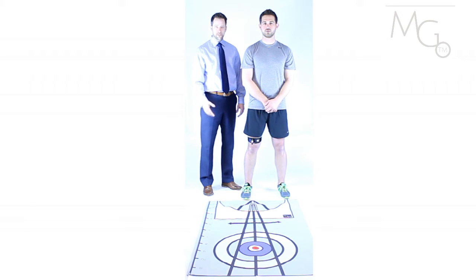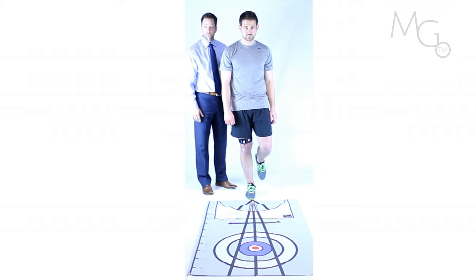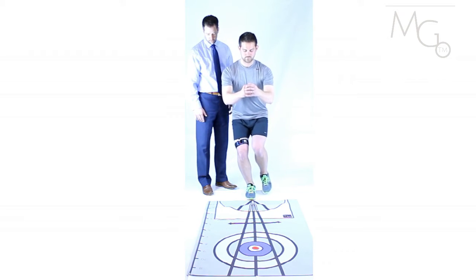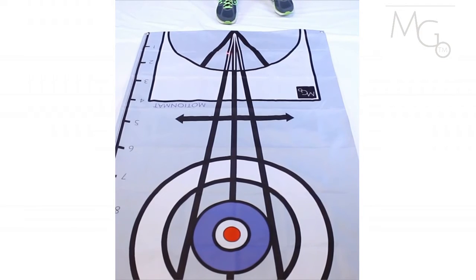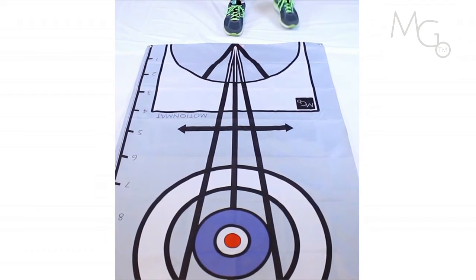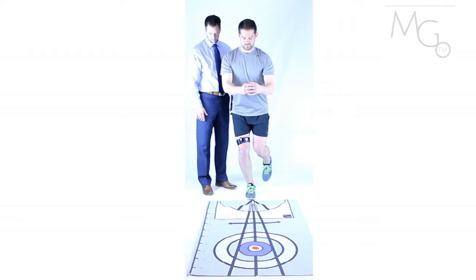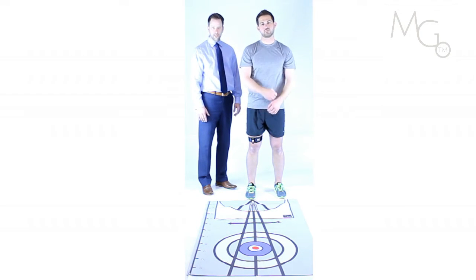After performing squatting activities, we can progress this activity to single leg squatting. In this example, the patient would stand on the right leg and perform a single leg squat, again watching the feedback from the laser. This is an excellent way for both the clinician and the patient to understand what action is occurring and what needs to be changed or what needs to be exercised.